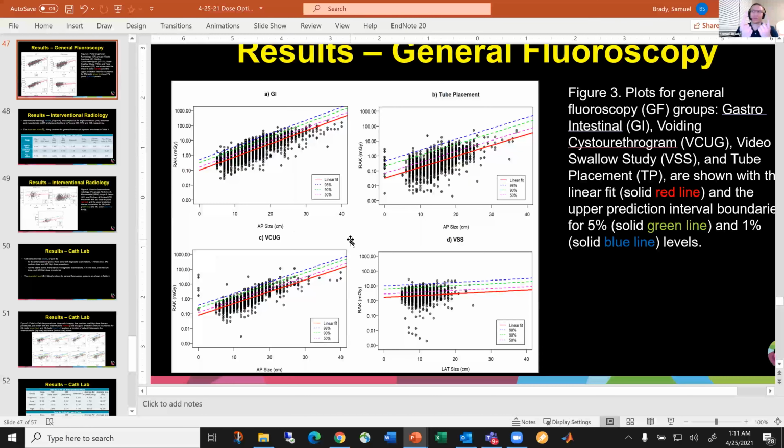I don't want to do all this tracking for two numbers. It's just I eat both. An alert system is only there for you just to go investigate, and so you only need one value. So pick one of the two. I personally pick air kerma, and air kerma is important to me because that tells me something about risk now.